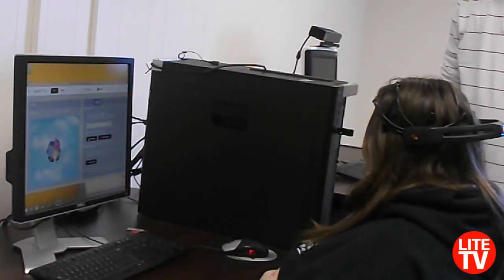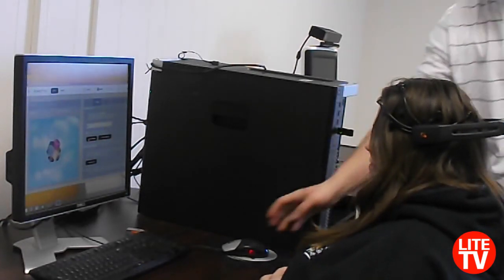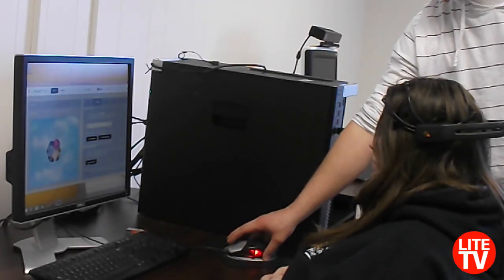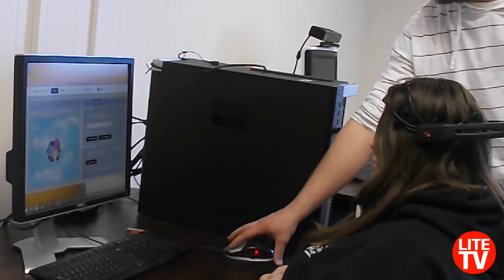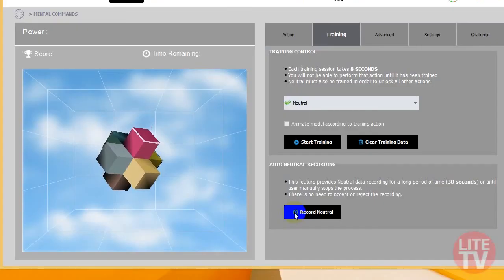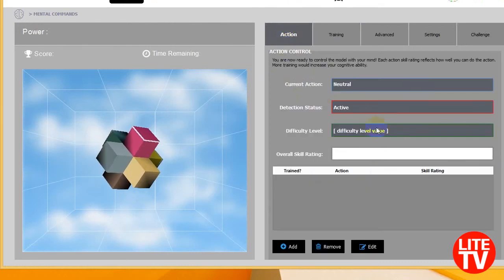What does it mean to be neutral? Just try to be neutral for 30 seconds. Just kind of stare at the wall or something. Okay, so your neutral state is recorded.